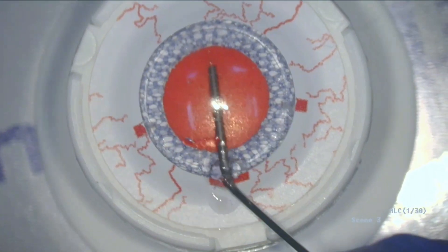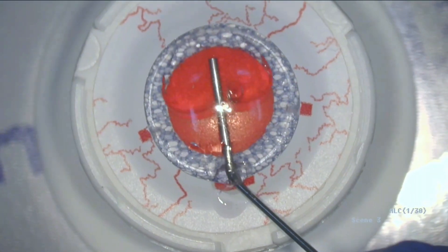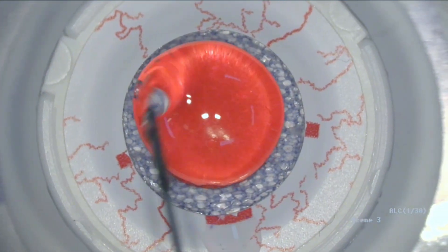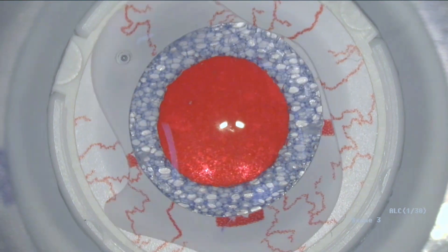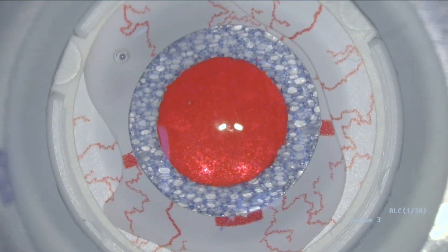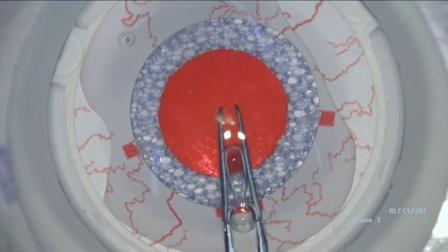Now let's fill the anterior chamber with some viscoelastic. I can even put some viscoelastic on top of the cornea — you can't do that with a lot of other eyes. This looks good.